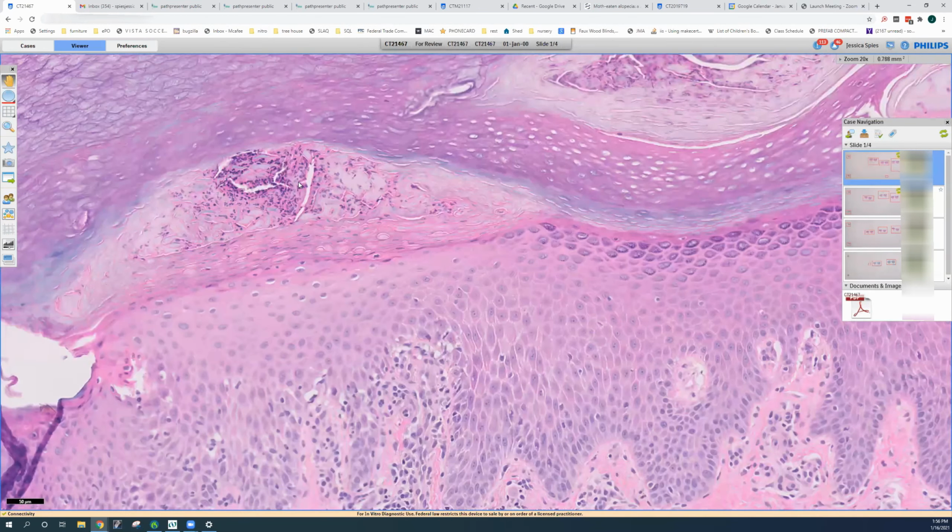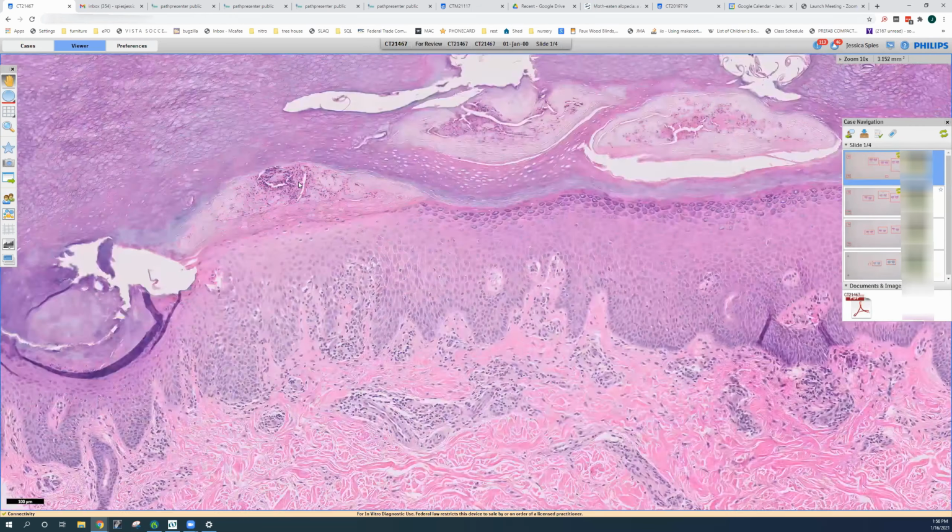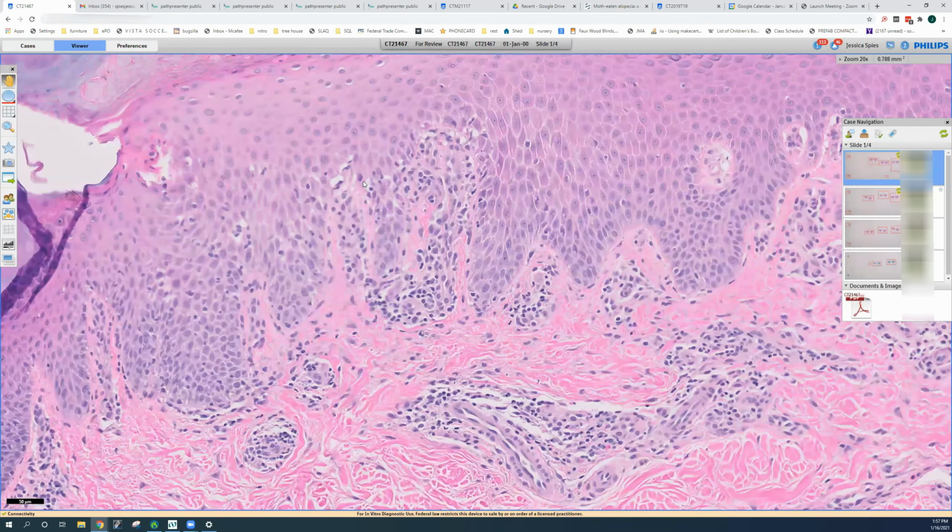Again here, oh, many neutrophils. And a little bit of spongiosis. So is this tinea? Is it eczema? This actually came in as rule out scabies. And you can see here are the pigtails of scabies. These are part of the exoskeleton of the scabies.